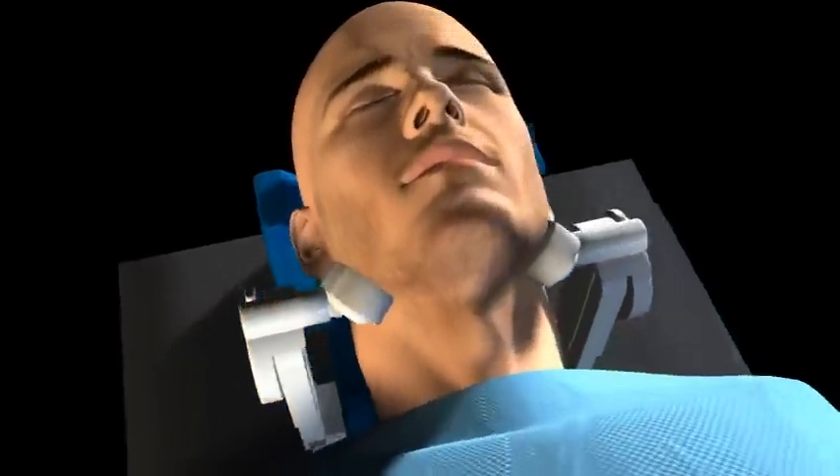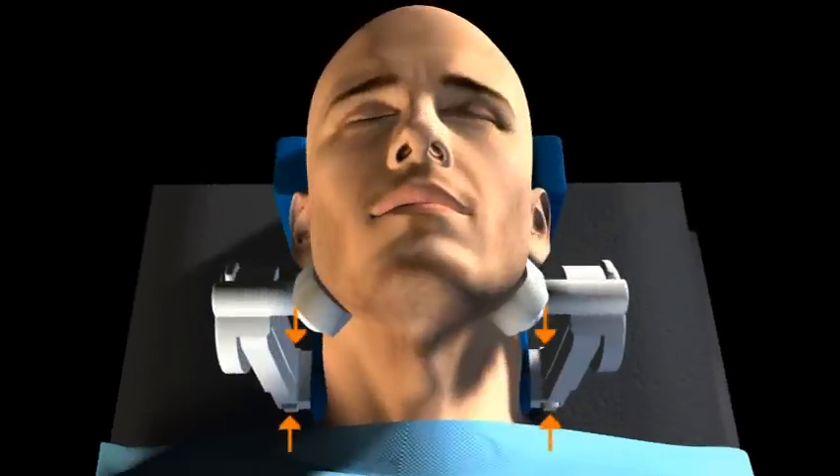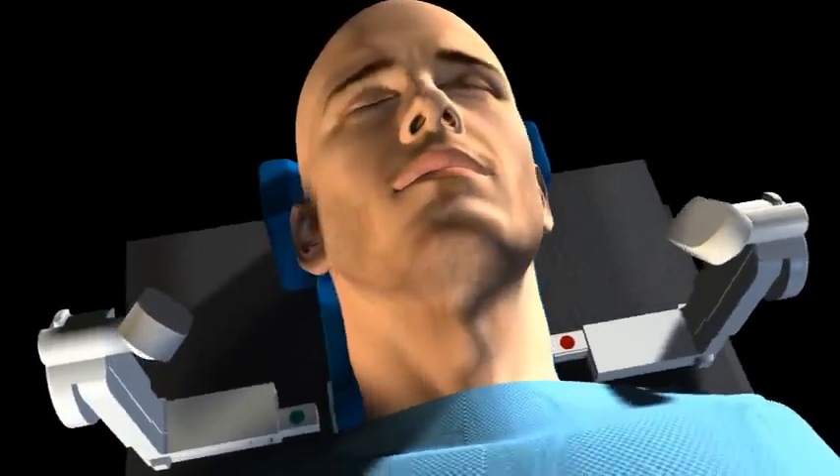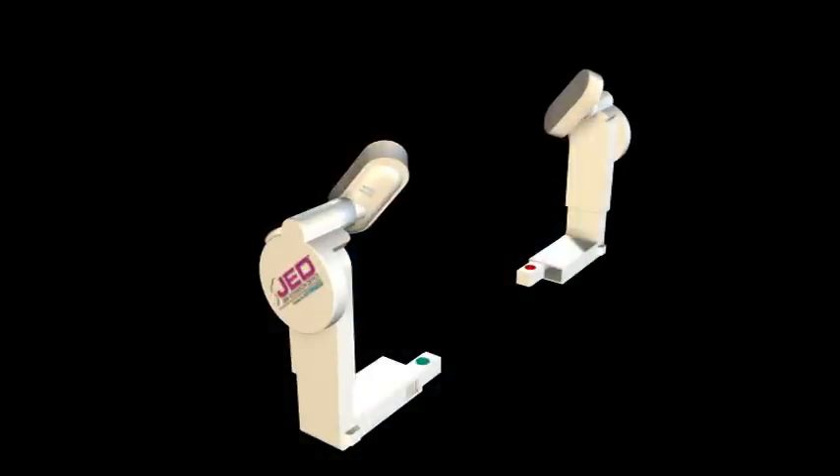To remove the arms, squeeze the two buttons at the bottom of the vertical support arms and pull outward to remove them from the head support. Remove and discard the disposable mandible cups.